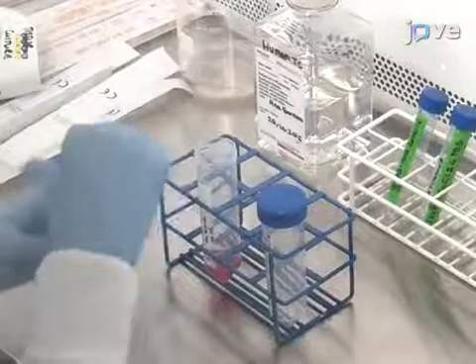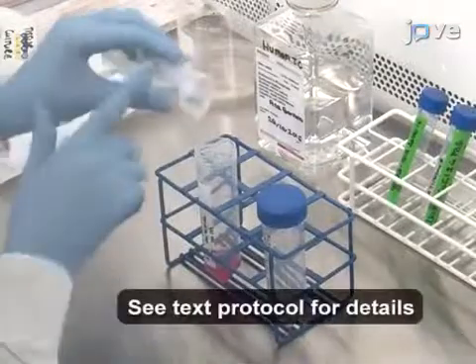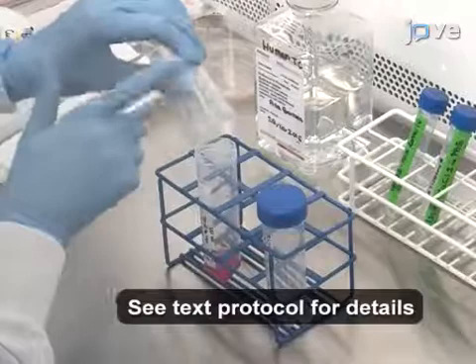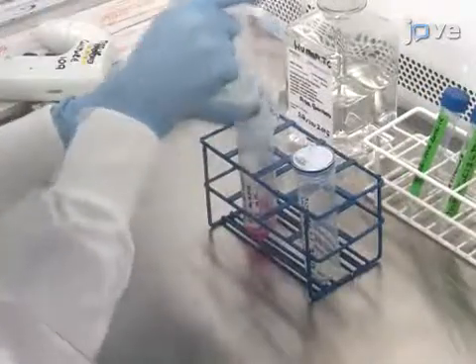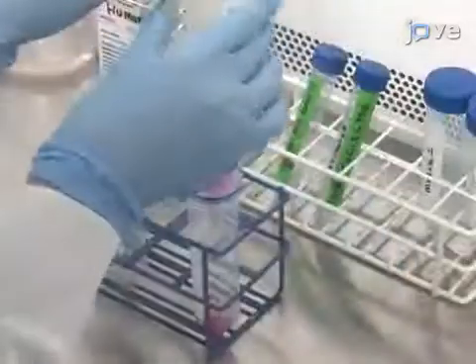Next, prepare the enzymatic solution in serum-free DMEM. Mix well and filter the enzymatic solution through a 0.2 micrometer filter membrane for sterilization.